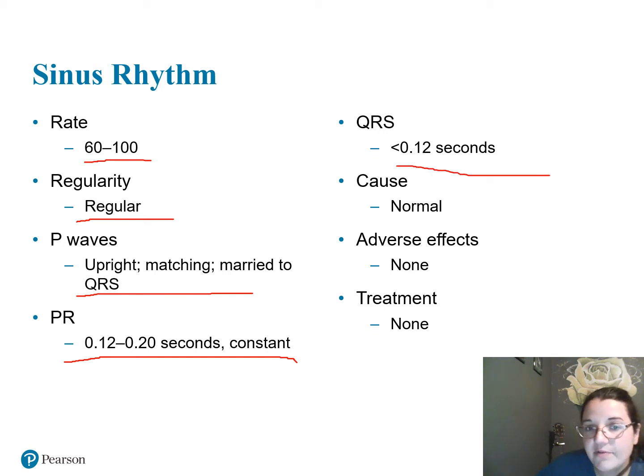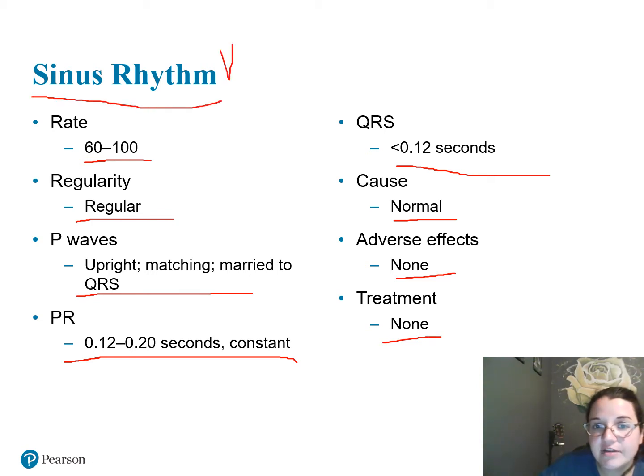And for me to have a sinus rhythm, the cause is going to be normal. I'm not going to have any adverse effects, and I do not need treatment because this is a sinus rhythm, which is normal.